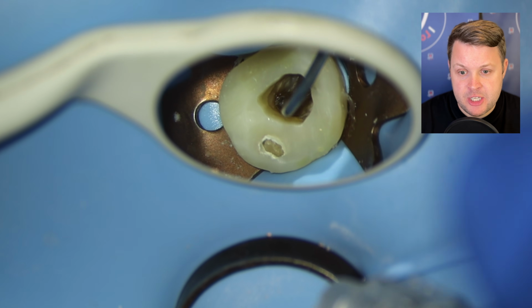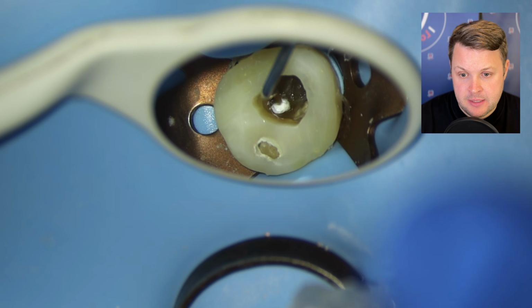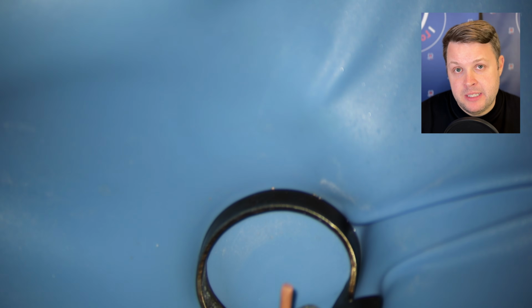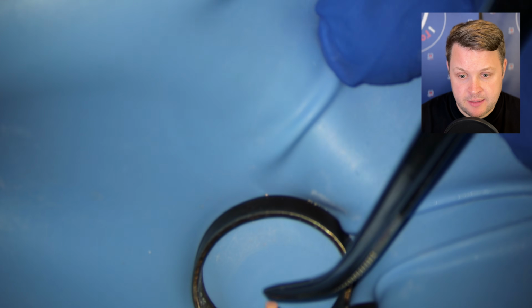In this case, I know that I haven't got 0, so I haven't obviously got patency with this canal. So what I'm going to do is fill the canal space right up with a bioceramic sealer all the way. And then I'm going to get my GP cone and really, really push this home. I'm not going to be gentle here.